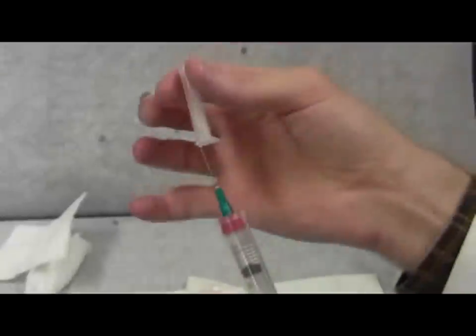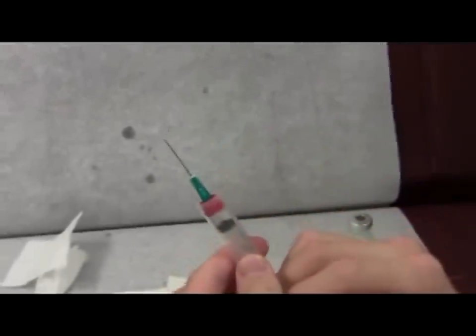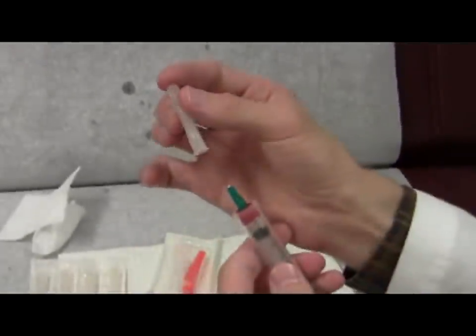Undo the cap but keep it over the needle — it's just loosely on. Eject the air, noting that some liquid will come out as well. The liquid comes out in the tip of the cap. Sometimes if you do this while the needle is off and you eject air, it spritzes out and can splash into somebody's eye. So you want to always let the excess spritz out into the cap, and then take the cap off.